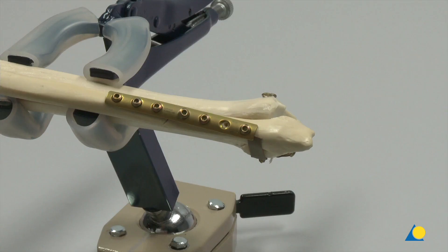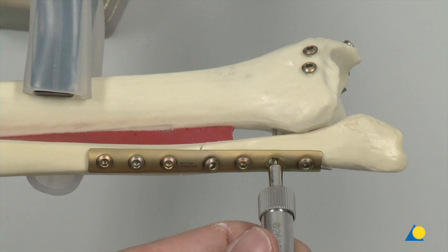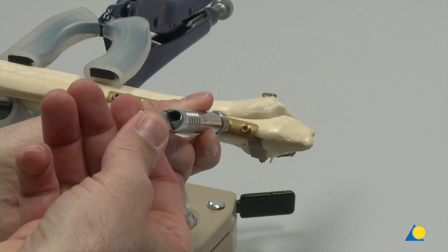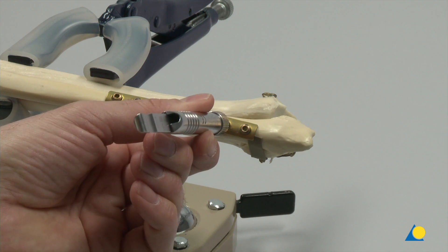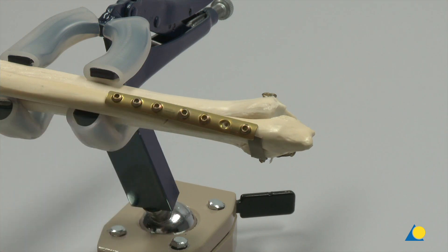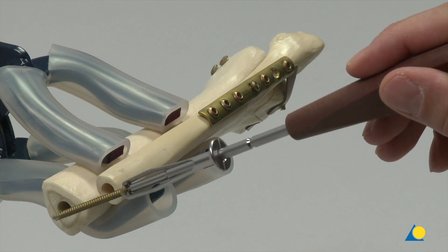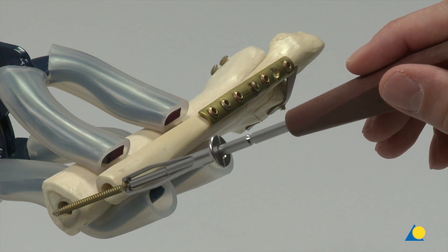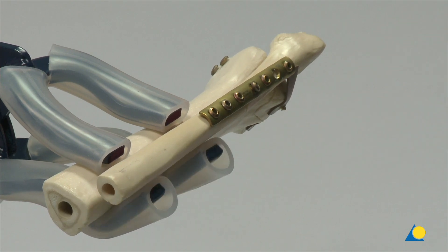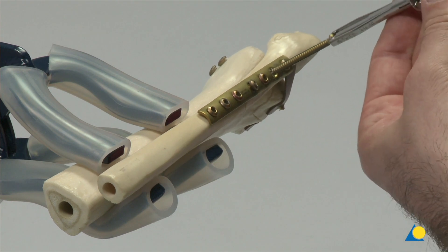The depth gauge is used to measure the required length of the screw. A screw of about 36 mm will generally be long enough. A 3.5 mm self-tapping cortex positioning syndesmotic screw is inserted using the hexagonal screwdriver.